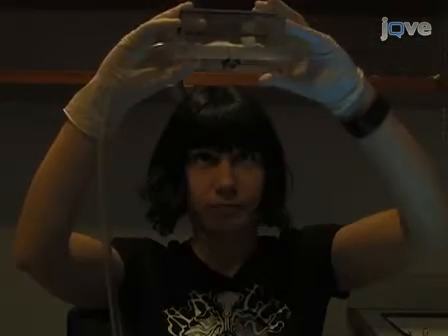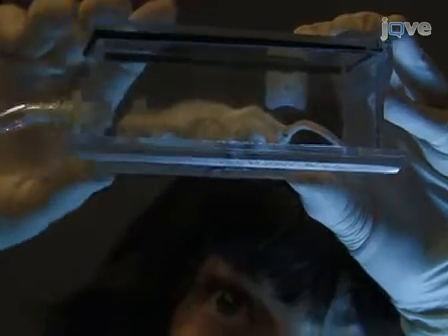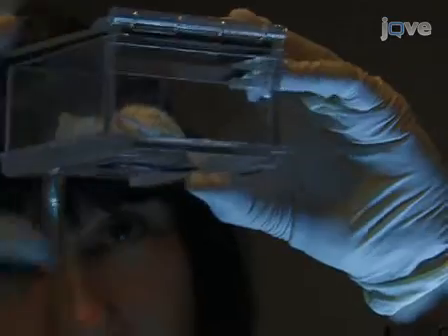Next, place the animal down so that the MIW is facing the bottom. Hold the box and adjust the bottom doors so that the MIW base is held and immobilized between them. The MIW base should be at the same level as the imaging box doors, while the MIW cover slip should be just a few millimeters below this level. Make sure that the positioning of the MIW between the bottom sliding doors ensures that the cover slip lies flat, parallel to the bottom doors of the box. This will allow for proper focusing.